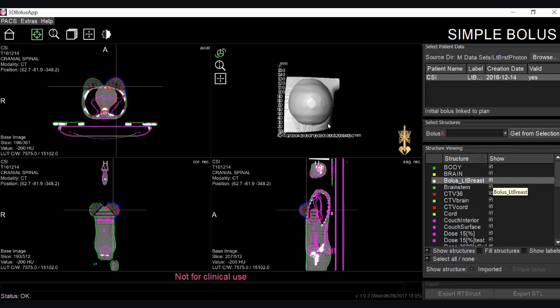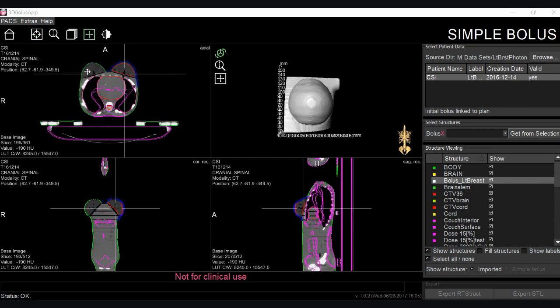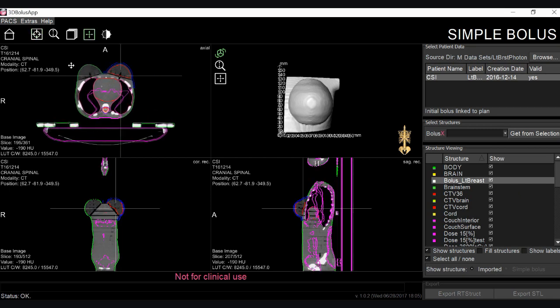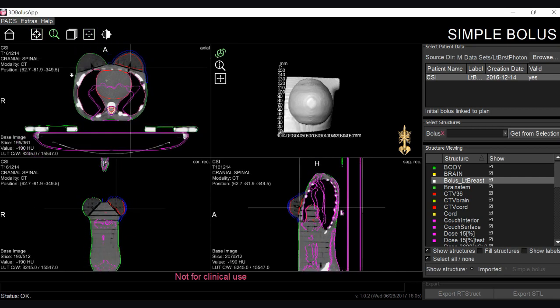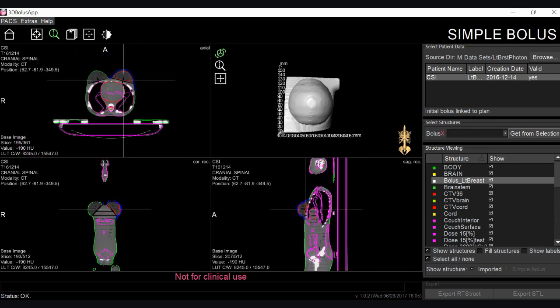The software is designed to resemble the treatment planning system with three planar views — axial, coronal, and sagittal — as well as a 3D rendering of the selected structure from the import list. Image manipulation including pan, zoom, and window level are all available within the three planar views.